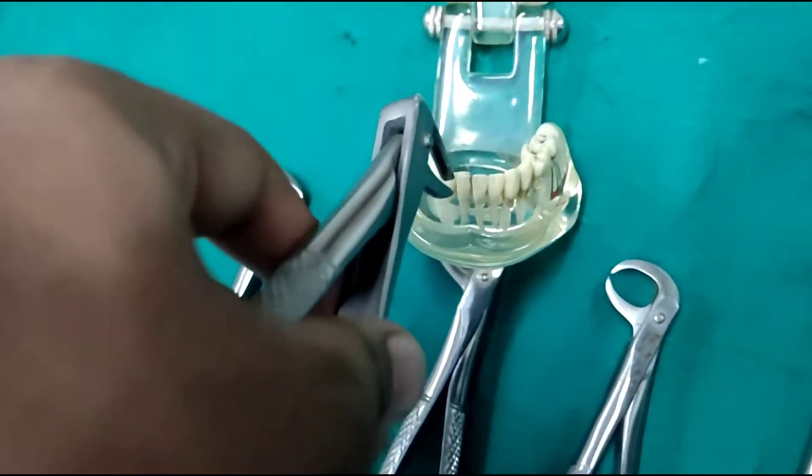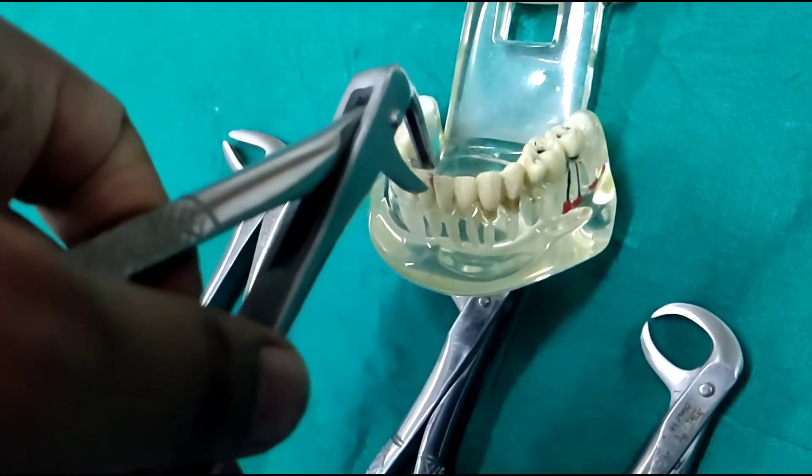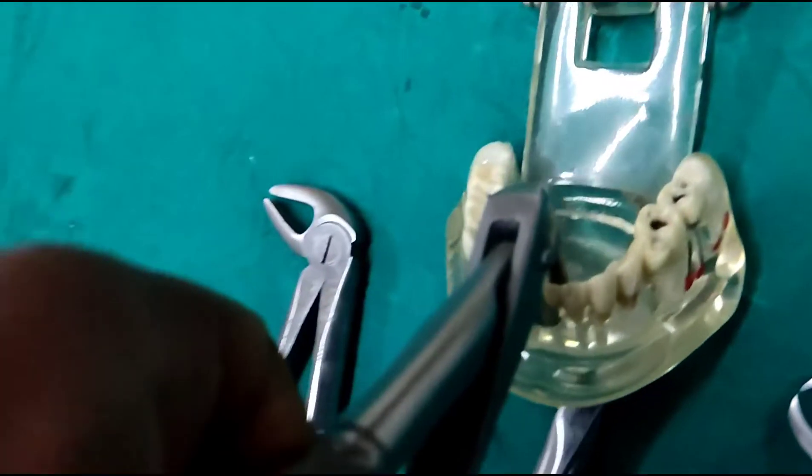Here I will show you how to engage the mandibular forcep and why the instrument is designed in such a way. This is how we engage the instrument.